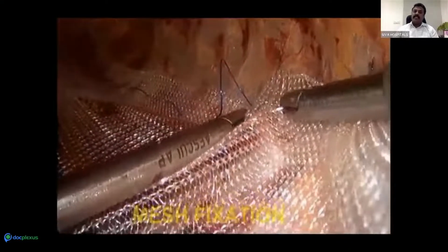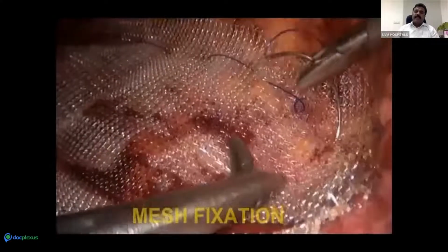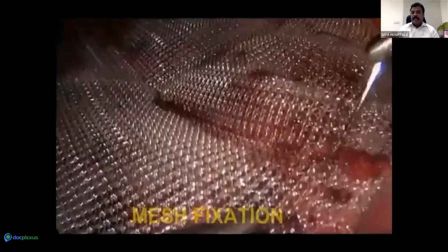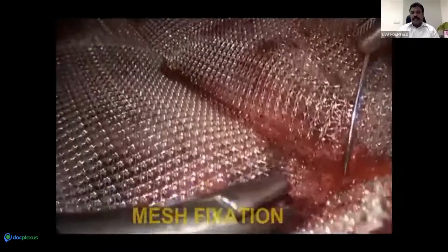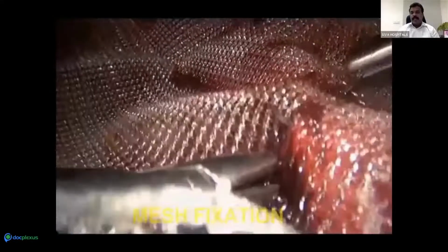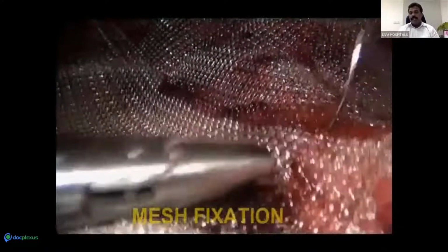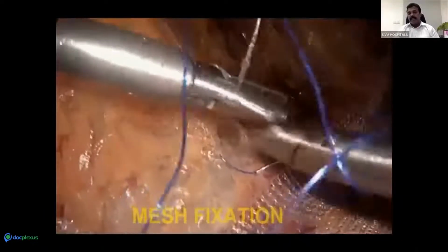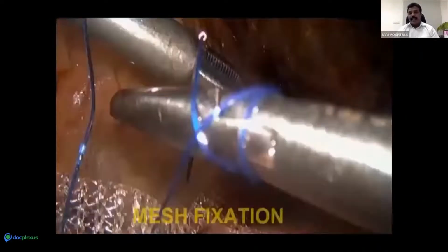The only problem is when you are coming near the pubic symphysis, because Western surgeons open around 2 to 3 centimeters at the pubic symphysis and the last knotting and suturing is done by hand. But here the whole suturing will be done laparoscopically itself, because I have changed the position of the camera to the right side.